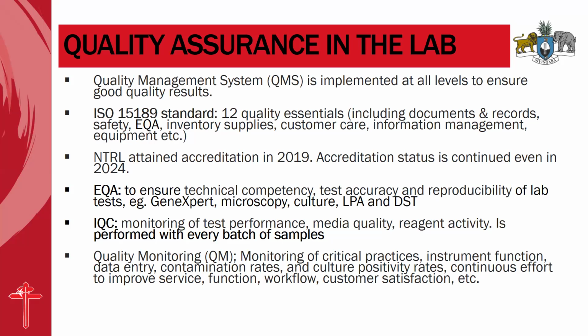Then we have the internal quality controls, the IQCs. They monitor the test performance, the media quality, the reagent activity, and are performed with every batch of the sample. So it's important to ensure that IQCs are being performed with each batch, and they are also monitored for performance to see if you are meeting the targets, and where not, to do investigative measures to detect the problem.